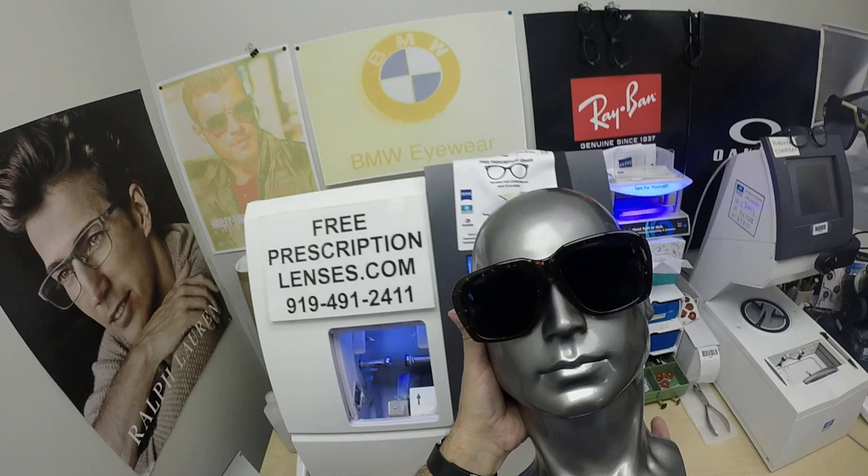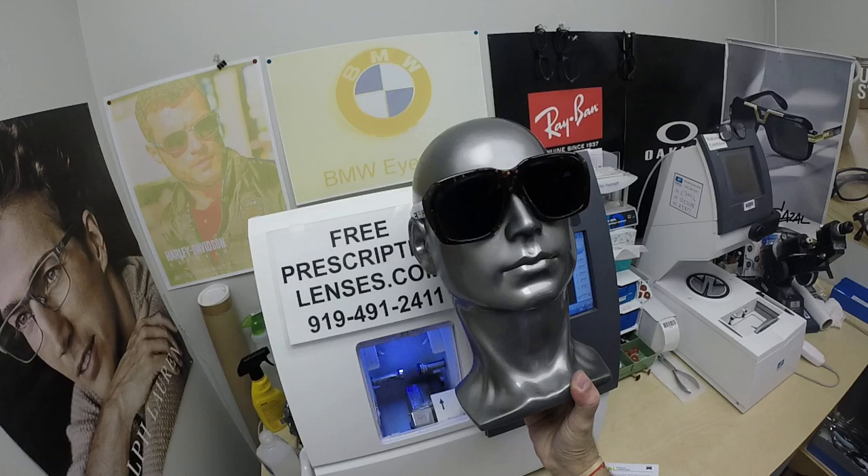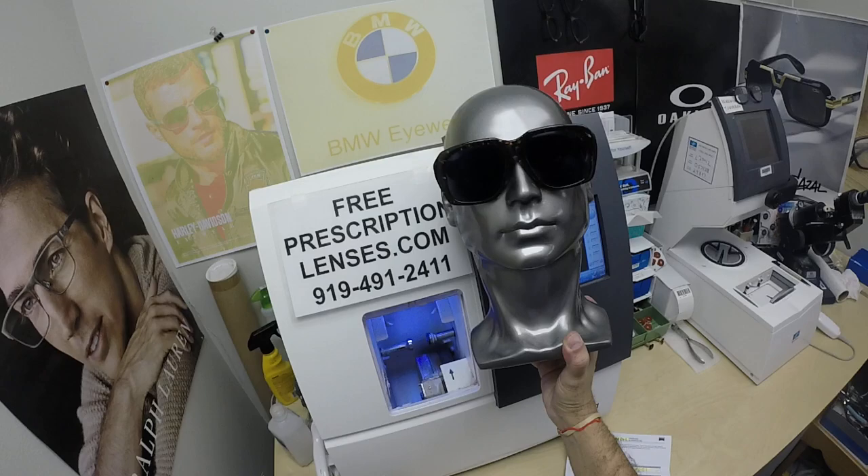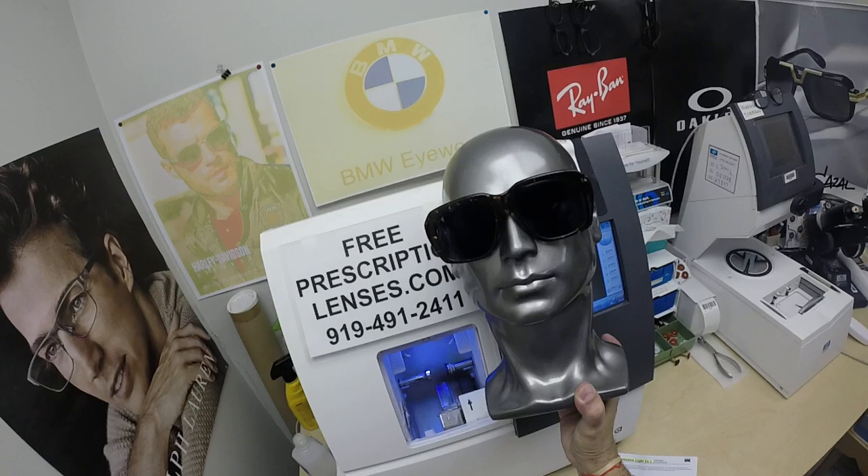Photochromic lenses are also temperature sensitive, meaning they will get darker when it's 85 degrees and below than they will when it's 95 and above. But I remind everyone: when it's 100 degrees outside, you're miserable, they're miserable — nobody or nothing works 100%. We all work much better when it cools off. Having said that, there is the Zeiss Photofusion Extra Gray that will get darker in hotter weather. It's designed for extra active people who spend extra amounts of time outside.